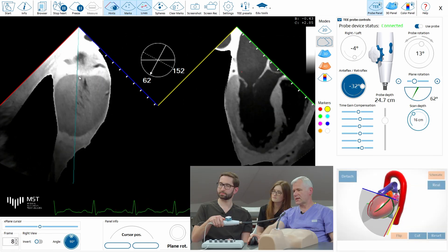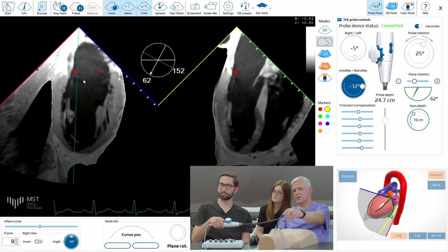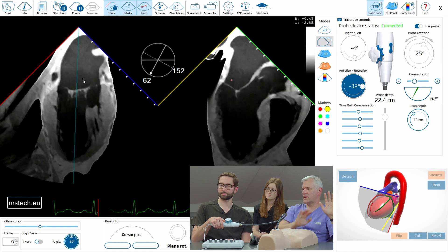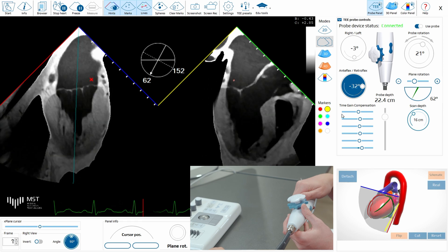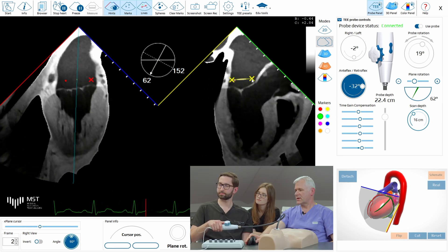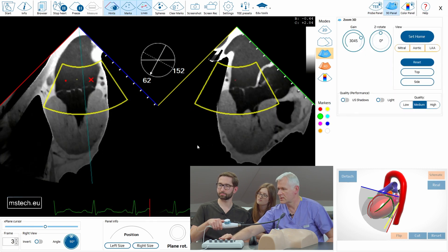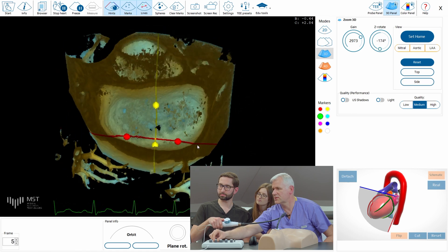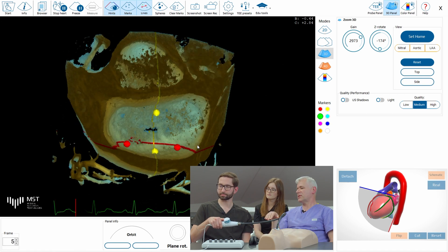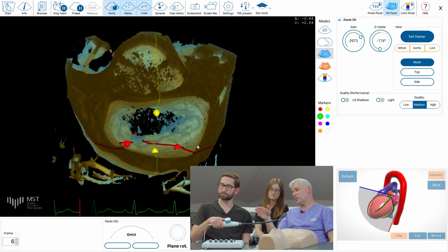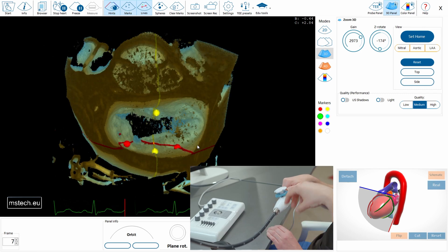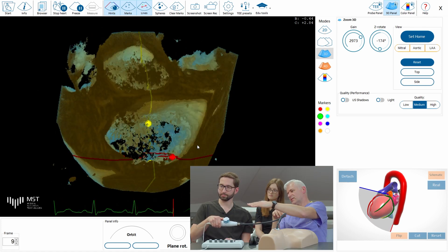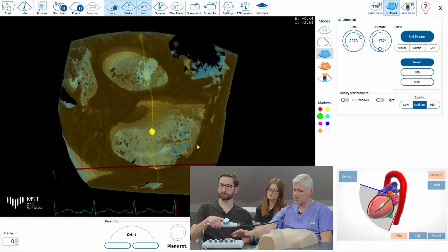You see your line is not exactly at the center of the valve. You can pull back the probe a little bit and on the left image the intercommissural view will move parallel, and you will see the long axis view very nicely. Let's put the crosses and see what we've done. It's slightly off axis — the red line is a little bit posterior, so this needs to be corrected. The yellow line is more or less okay, just in the center of the valve. By clockwise rotation you are changing the position of the valve, which would move the red line towards the aorta.